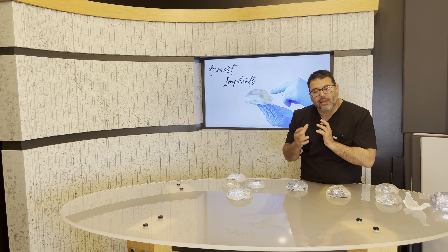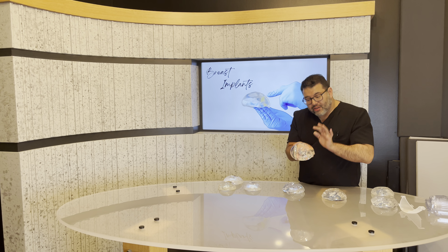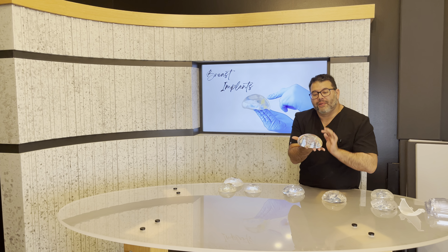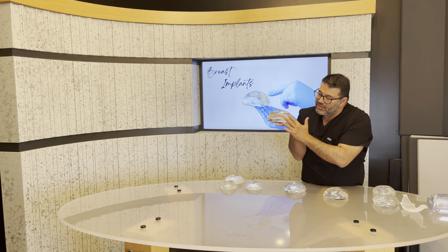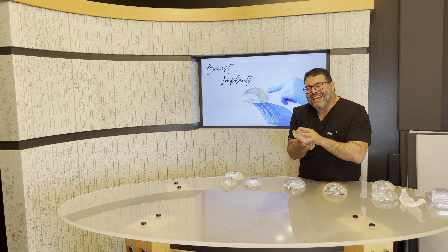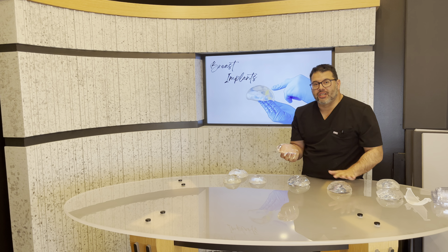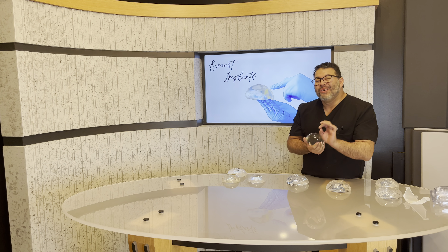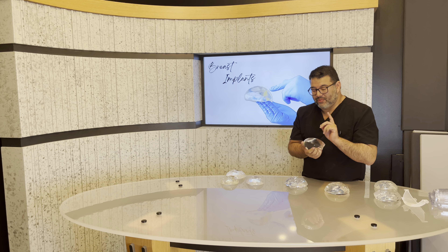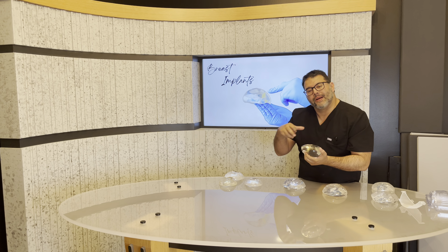The idea behind a gummy bear plus implant is that the gel is just a little bit more cohesive. I don't want to grab the implant because then you guys will know which one I'm talking about. Here's another plus — the edges are just super smooth, so the gel is a little bit more form stable. Surprisingly, it's very soft. Maybe we'll test one of our nurses and have them touch each one and see if they can tell from feel which is the more cohesive gel.